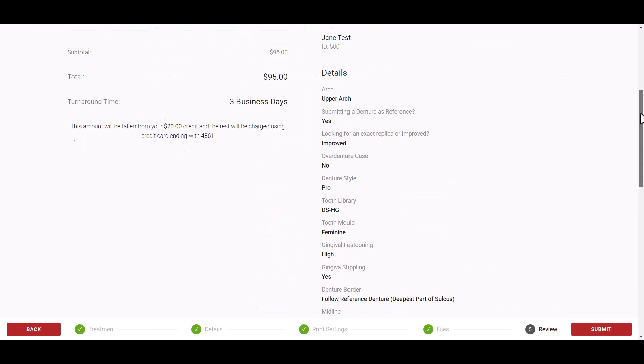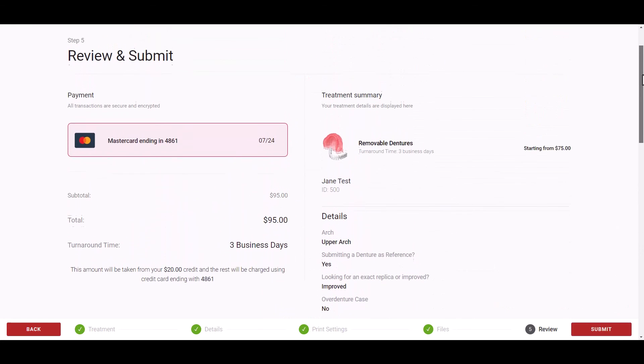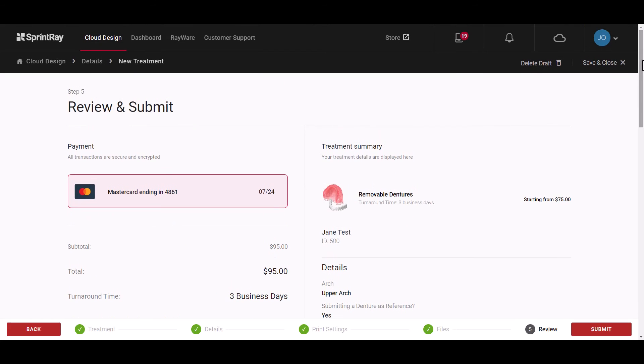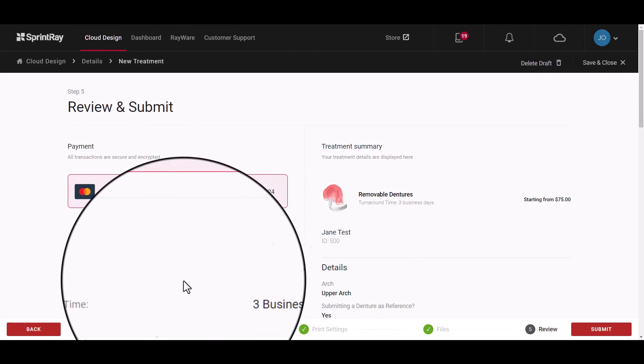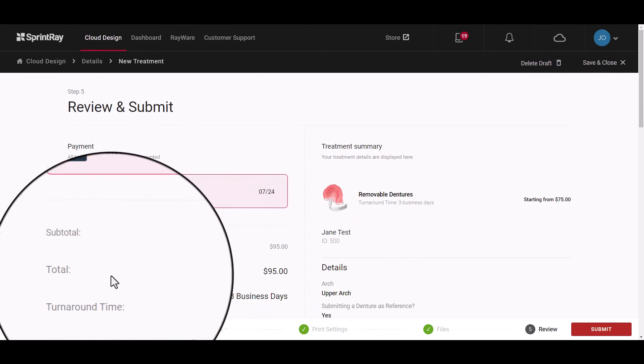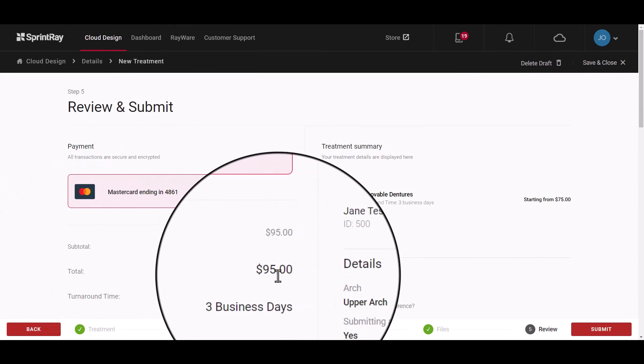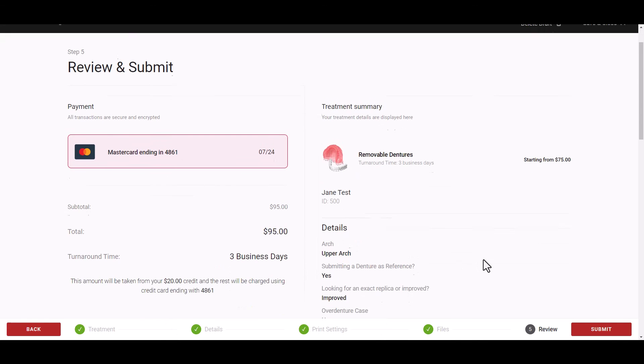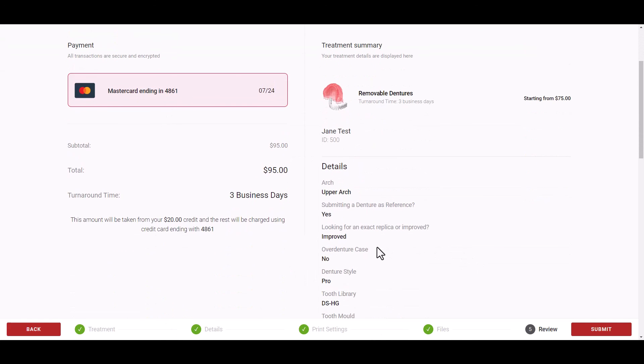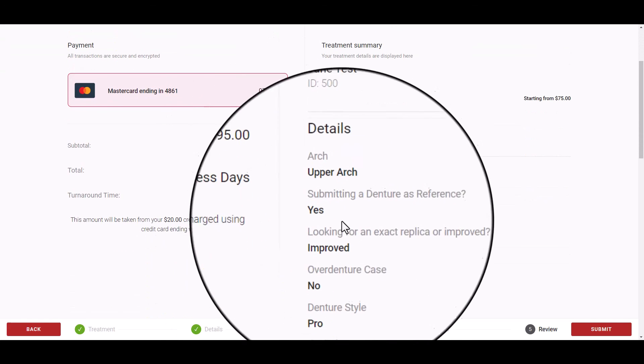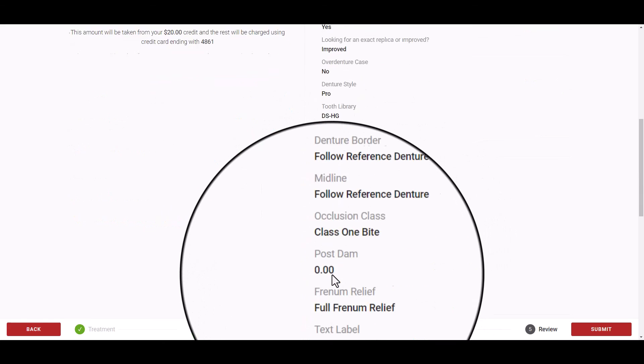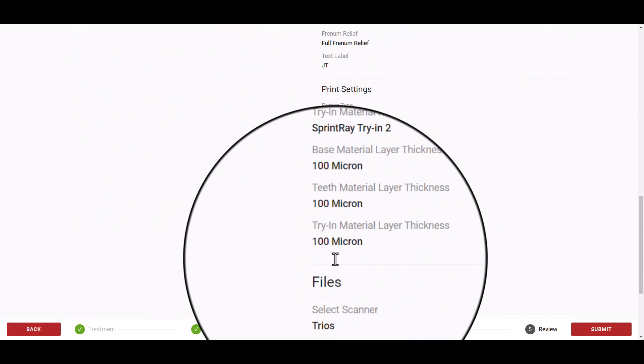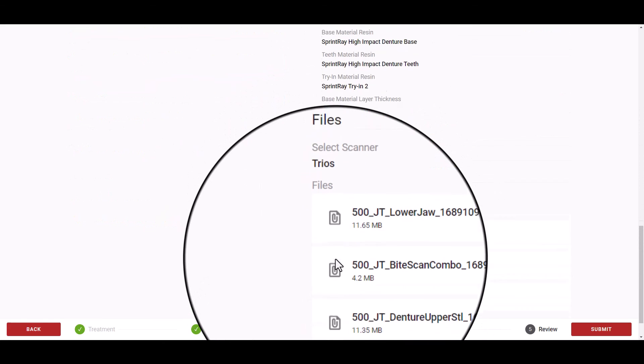Before final submission, you will have the ability to review all of the Denture Design options you have selected and verify the final charges to your linked credit card. Once you are finished, click Submit.